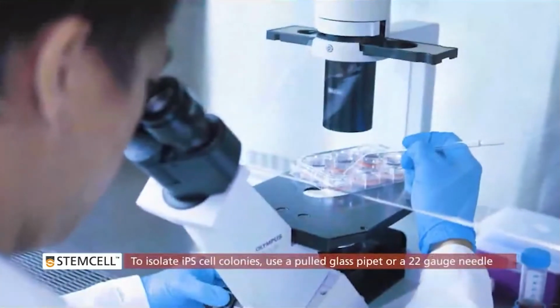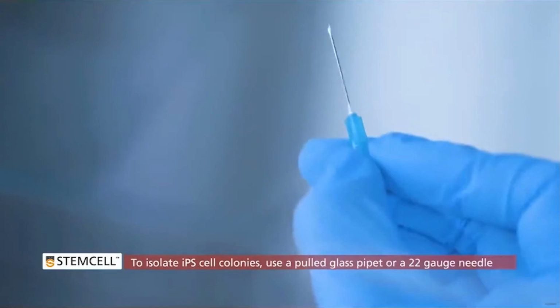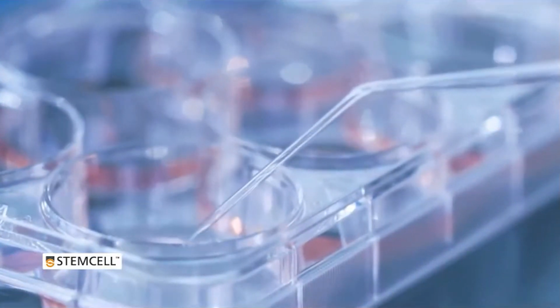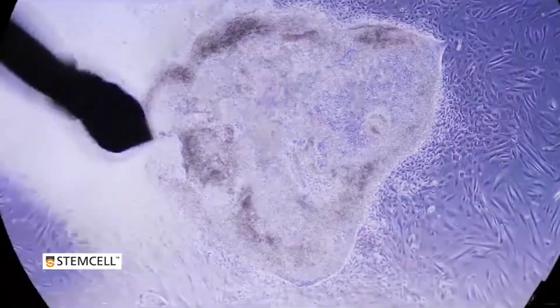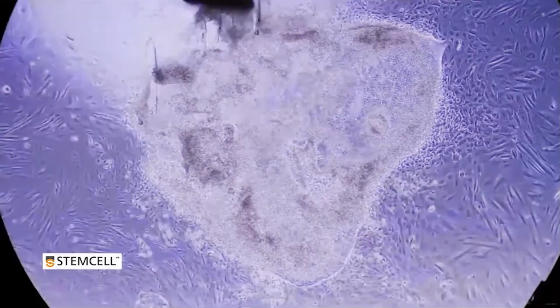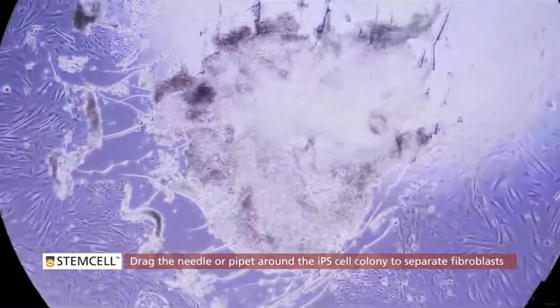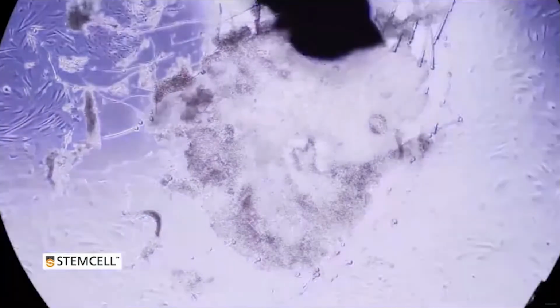To isolate the iPS cell colonies, either a pulled glass pipette or a 22-gauge needle is recommended. Colony isolation should be performed using a microscope in sterile conditions. Sometimes the colonies you want to select may contain differentiated cells or fibroblast overgrowth. These unwanted cell types should be removed from colonies prior to isolation. Drag the needle or pipette around the iPS cell colony to separate the fibroblasts or other unwanted cells from the undifferentiated iPS cells you are selecting.